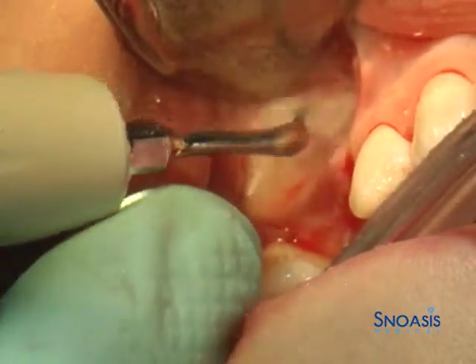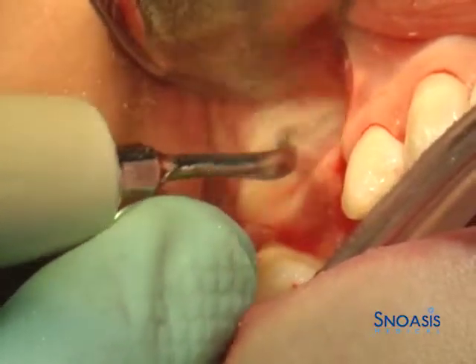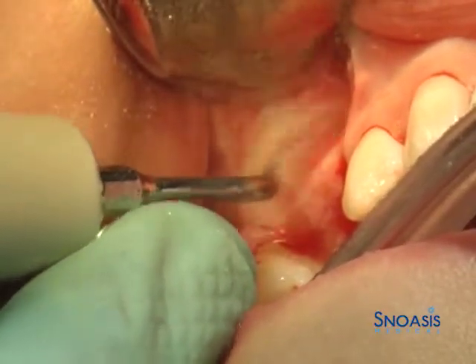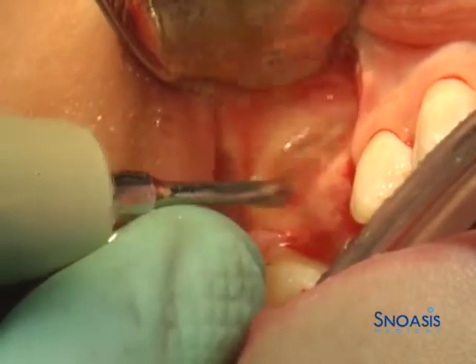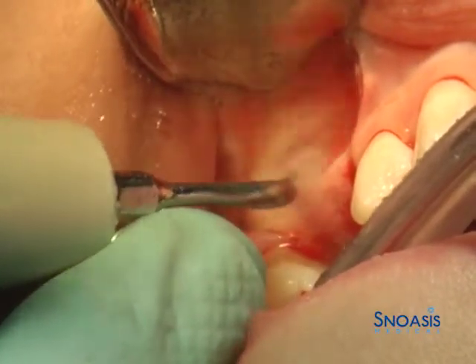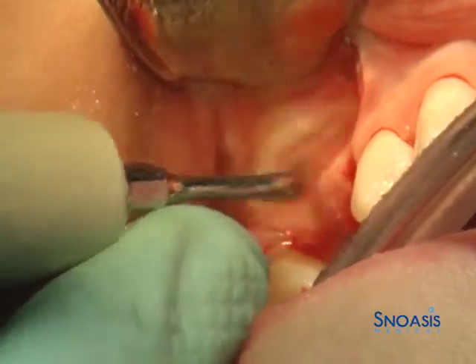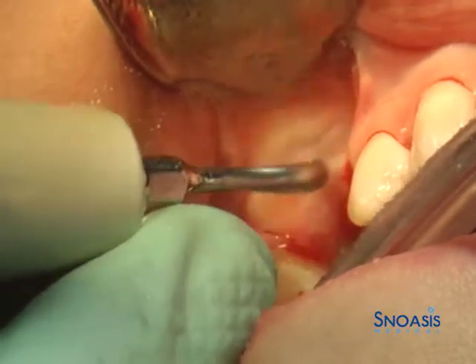The piezo-surgical handpiece is utilized with a diamond round bur to perform the final osteoplasty to the level of the Schneiderian membrane with minimal chance for perforation, given the unique qualities of the piezoelectric handpiece.